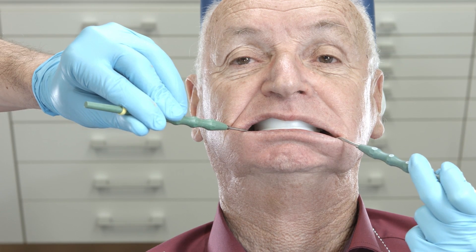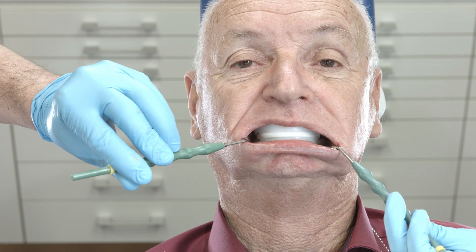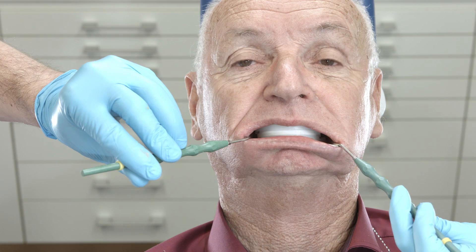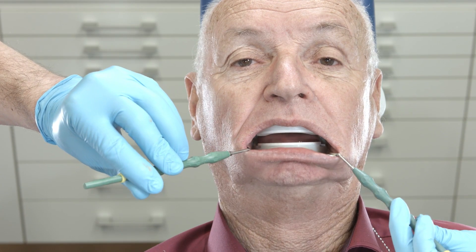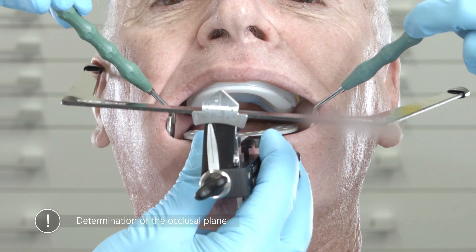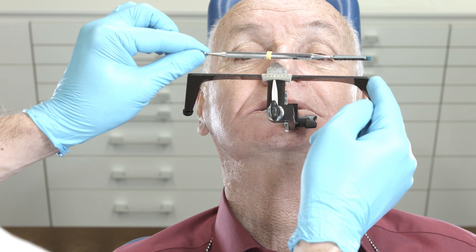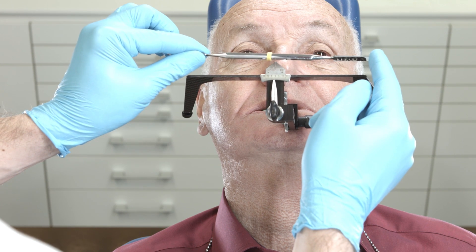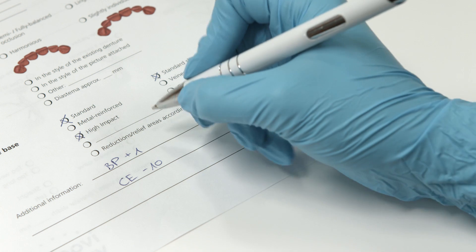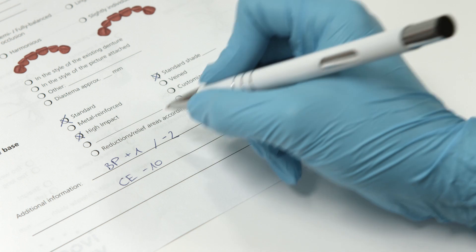Check the stability and suction of the impression. When the jaws are closed, the bite plates should be positioned flat on top of each other. Now you can determine the final position of the occlusal plane. Align the basic bow of the UTS CAD parallel to Camper's plane and the bipupillary line using the bite fork. Record the measurements and send them to the dental technician for the denture design.